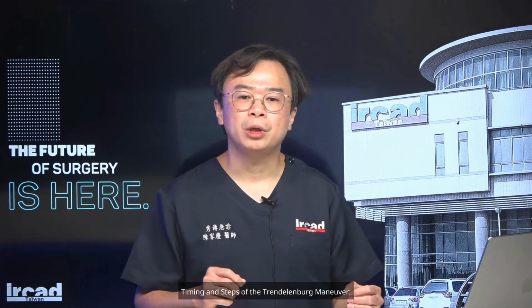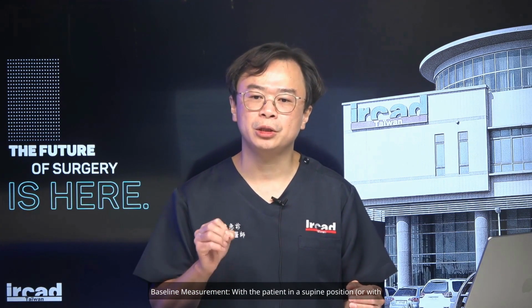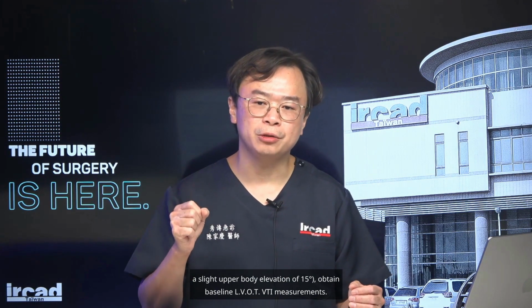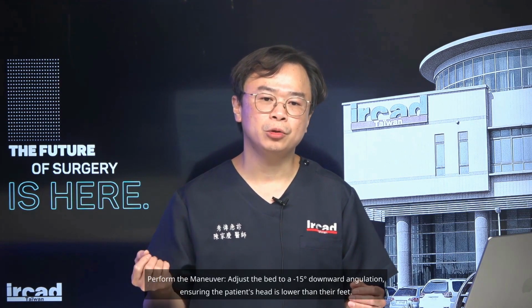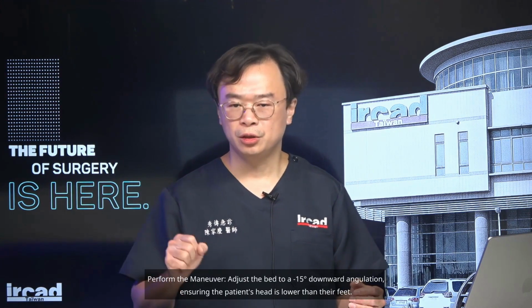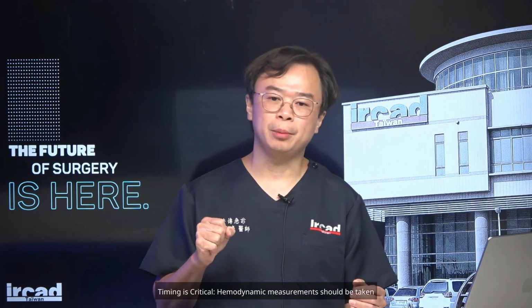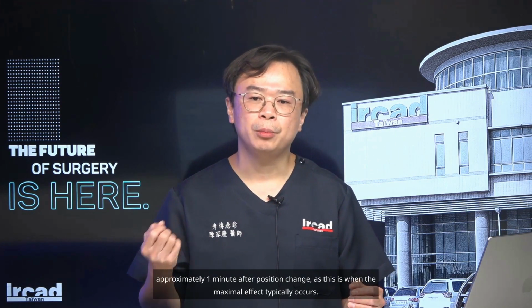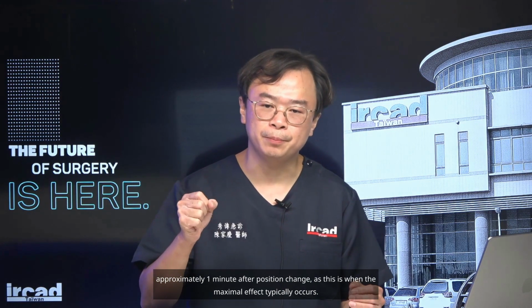Timing and steps of the Trendelenburg maneuver. 1. Baseline measurement. With the patient in a supine position or with a slight upper body elevation of 15 degrees, obtain baseline LVOT VTI measurements. 2. Perform the maneuver. Adjust the bed to a 15-degree downward angulation, ensuring the patient's head is lower than their feet. 3. Timing is critical. Hemodynamic measurements should be taken approximately 1 minute after position change, as this is when the maximal effect typically occurs.